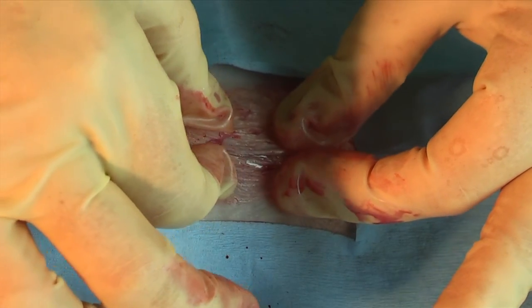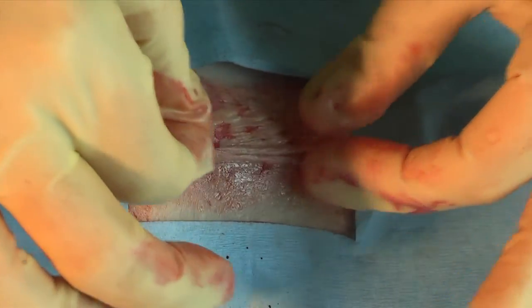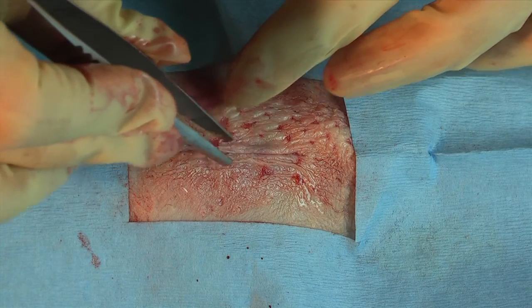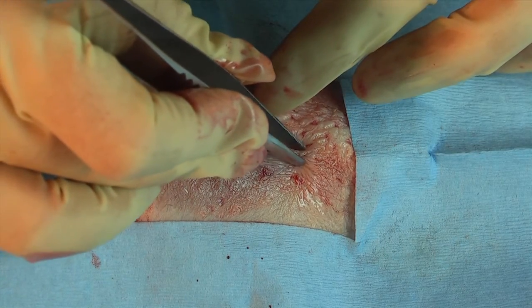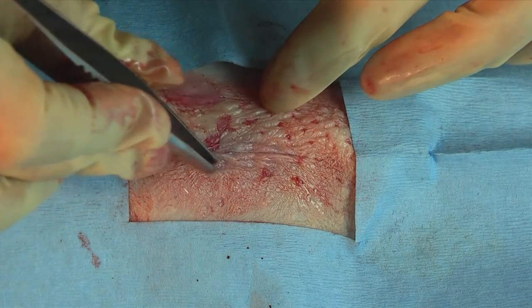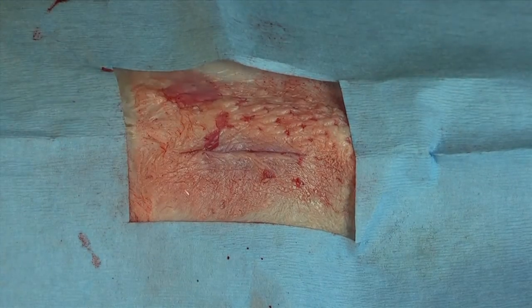Now you can hold your skin edges together for five to ten seconds. Avoid touching moist surfaces with the applicator tip. Do not apply Dermafuse internally or below the epidermal layer. After completing the procedure, check for bleeding. You can reapply a drop of Dermafuse to the skin edges if required.